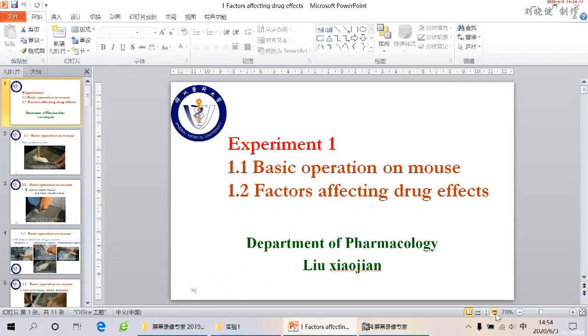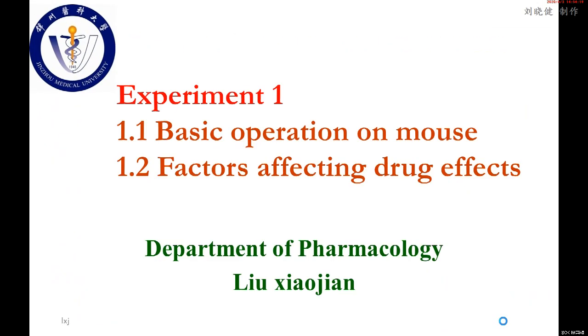Hello everyone, welcome to the experimental class of pharmacology. This is the first class. So during this experiment, you first study basic operation on animals.